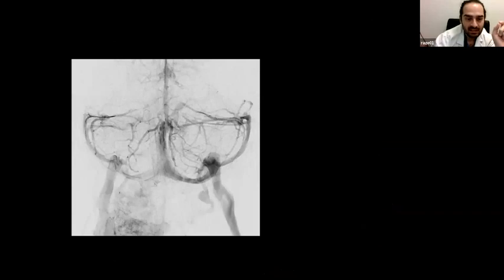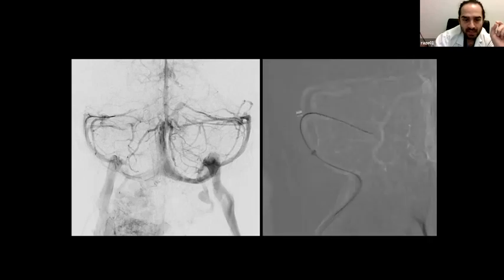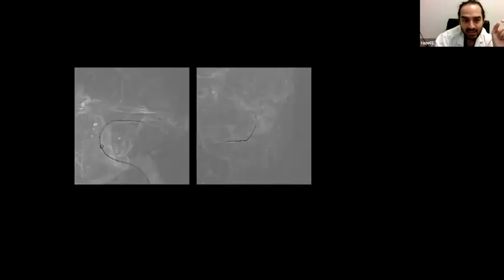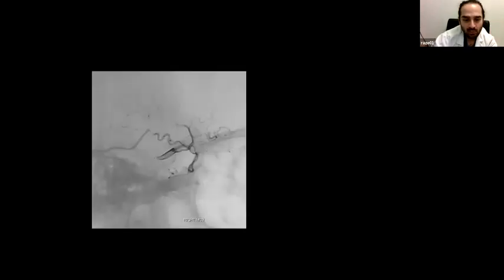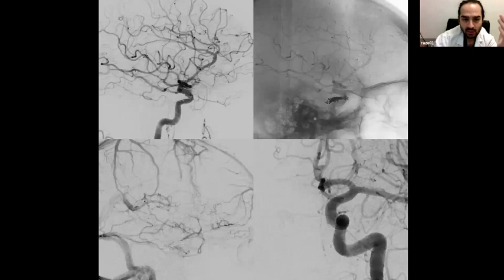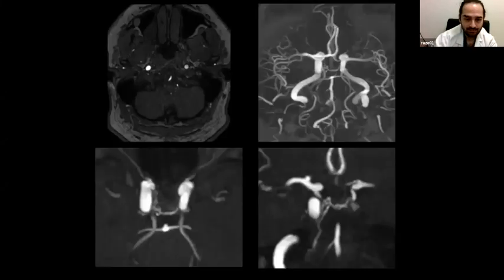And this is an image that shows the more lateral part of the superior petrosal sinus. So this is going to be our access from the jugular vein going up here and going medially. And then we're going to try to go through this sort of blinded segment and maybe get to the fistula. And we did that, and very gently, the wire went through, and that's how we get to the posterior part of the fistula. And indeed, we were able to coil the fistula, close it off, and cure this fistula with a safe transvenous embolization, thanks to the images that were provided by the DynaCT.